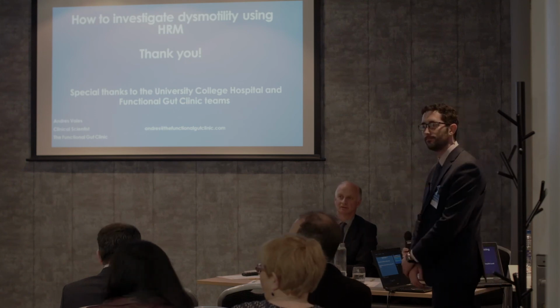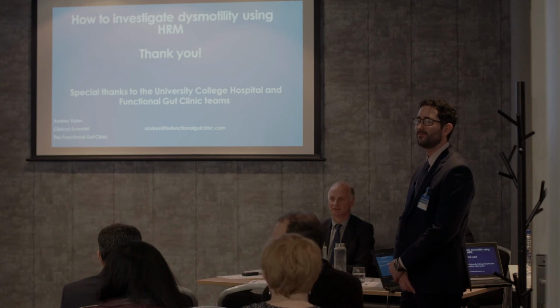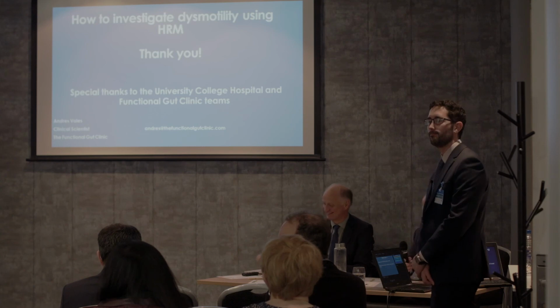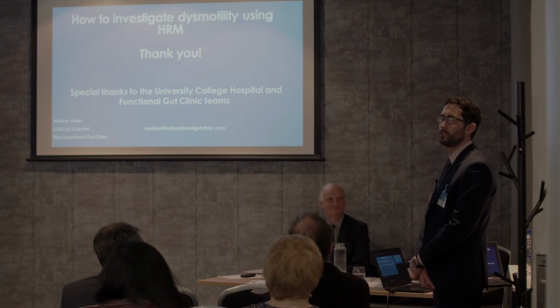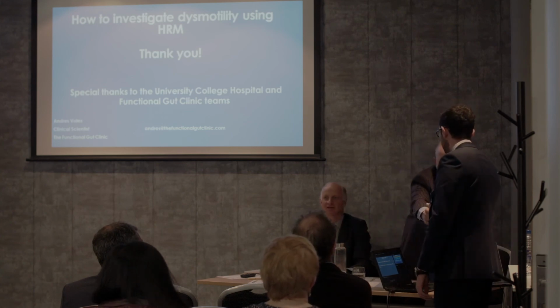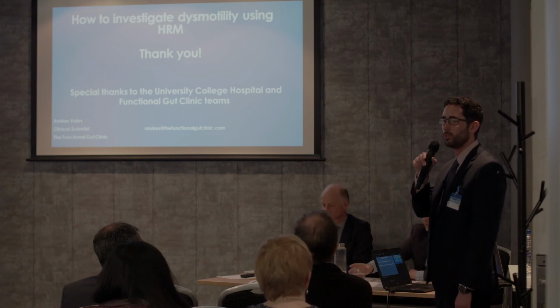Just say, barium swallow reports notoriously come back saying there's an element of dysmotility. And often I've sent these patients for oesophageal manometry and it's been fine. So how reliable are barium swallows? Not particularly. You see this a lot in the report, the tertiary contraction.